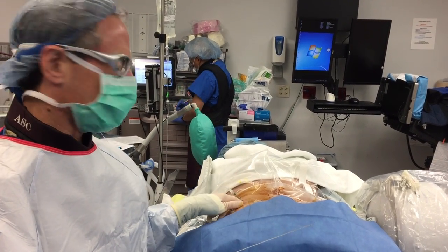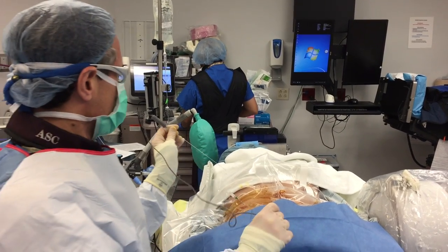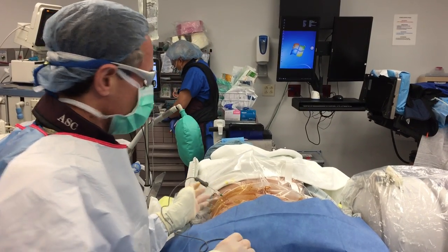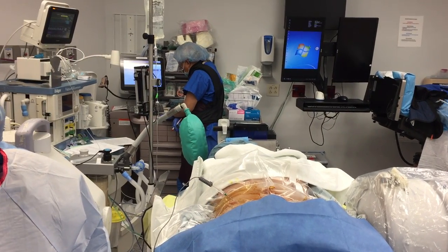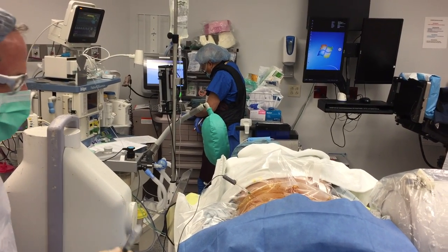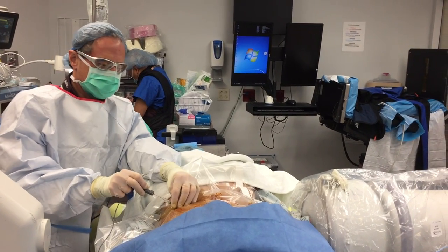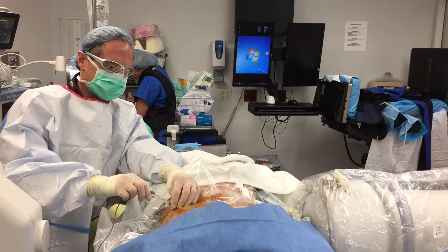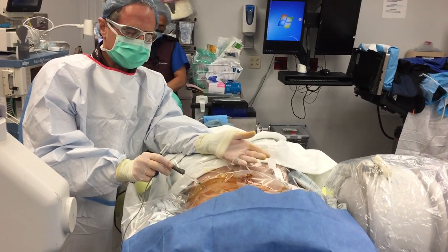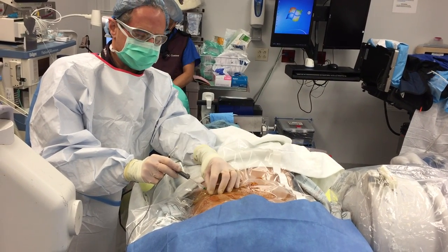You see there's no incision. We just put in a trocar here and we're putting this into the L5S1 disc where we're going to decompress the disc so that it reduces the size of the herniation. This is a great minimally invasive treatment for the right patient to avoid surgery.